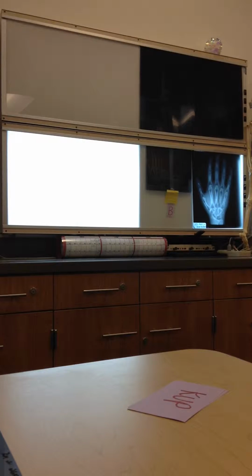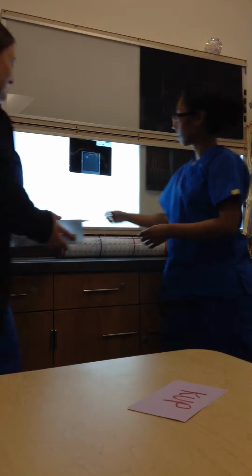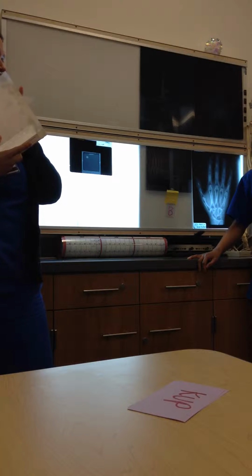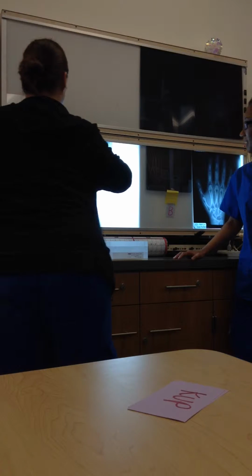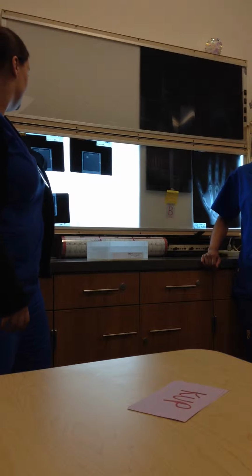Okay. We're pretending a little bit with theirs because I don't actually have a mammography phantom. This is our pretend mammography phantom. Oh, it's not. It has dots in it. See the dots. So you want to measure the dots, the fibers, the masses. Well, the dots are the masses. But the specks, what do we call them? Threads. Specks. Fibers. Fibers and masses.